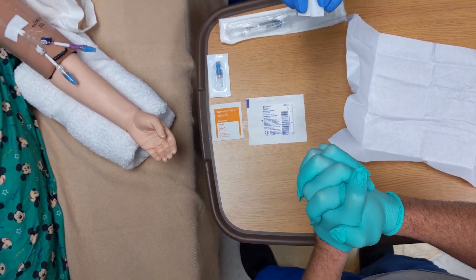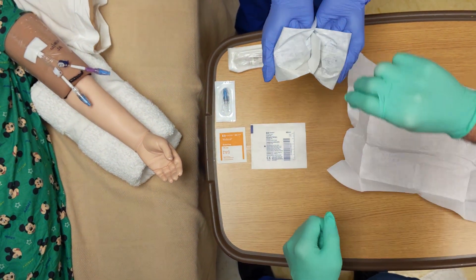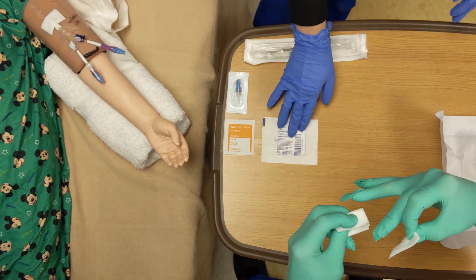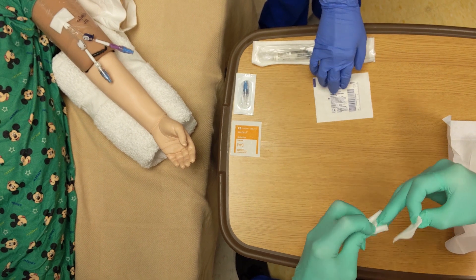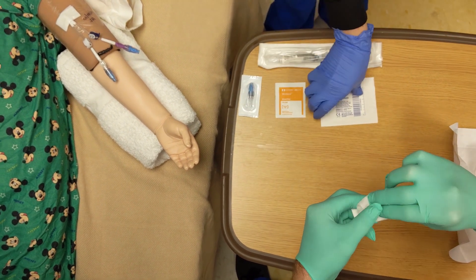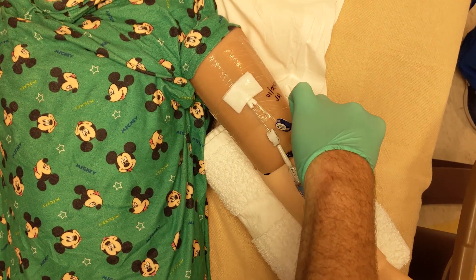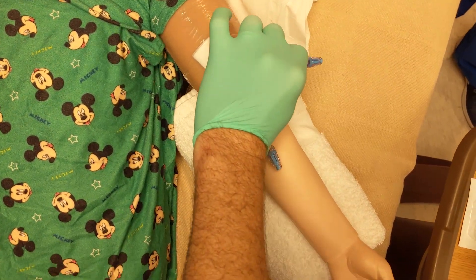Once you have your sterile gloves on, the person helping you will open a package of sterile gauze. Grab the sterile gauze without touching the outside of the packaging — this will keep you sterile. Using the gauze, pick up the line of the cap that you are going to change without touching the line with your sterile gloves.